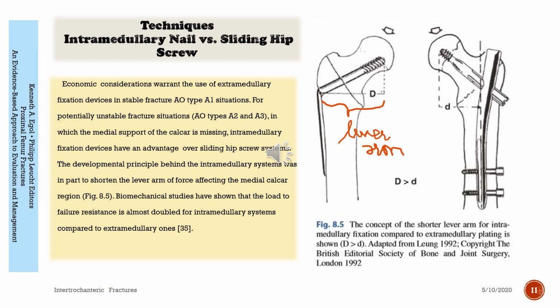The developmental principle behind the intramedullary system was in part to shorten the lever arm of force affecting the medial calcar region. Look at the figure. Biomechanical studies have shown that the load to failure resistance is almost doubled for intramedullary systems compared to the extramedullary ones.